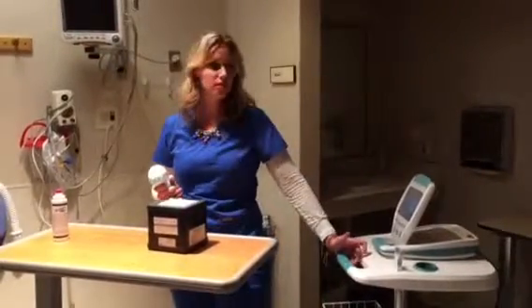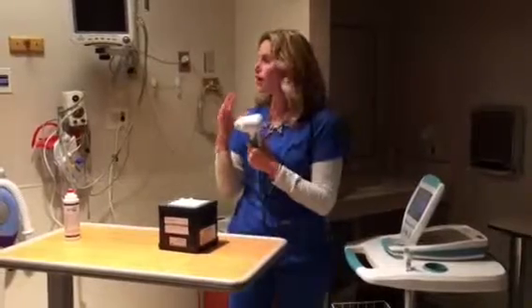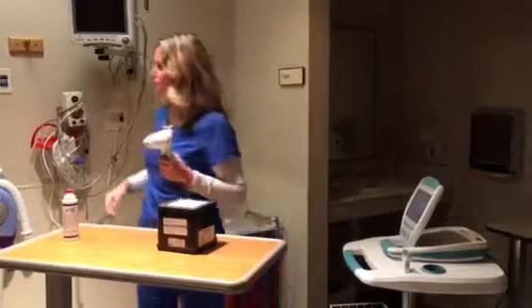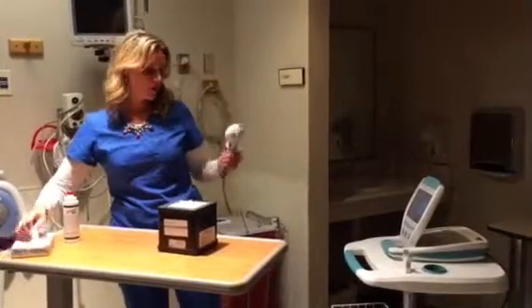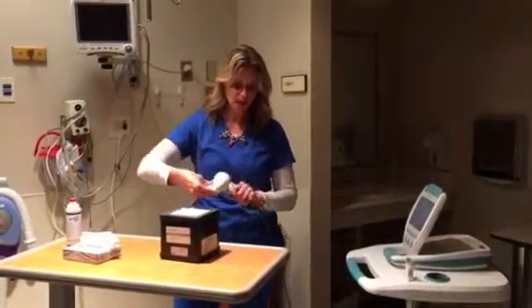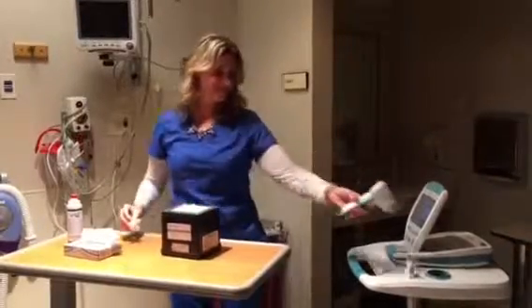Any questions? Oh, actually, lastly, you're going to clean the probe off with a tissue, if you wouldn't mind getting me a tissue there, and then a sani wipe that will wipe all the way down the probe, and then the cord, and then the front of the screen. And then you're all done.